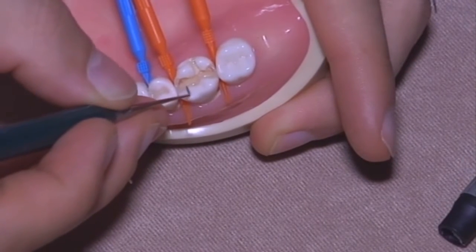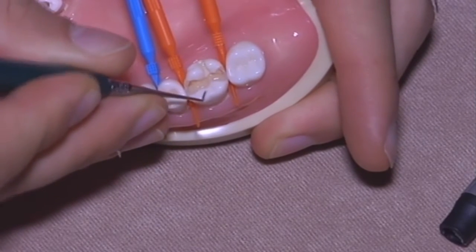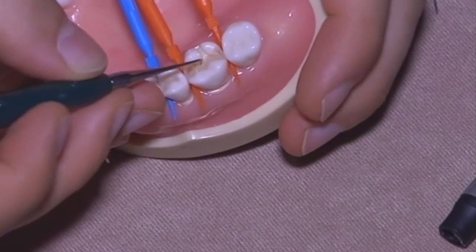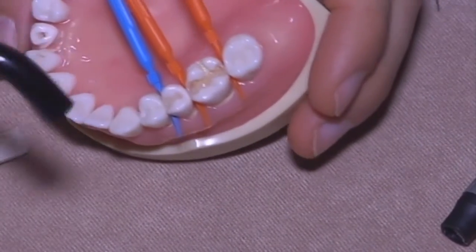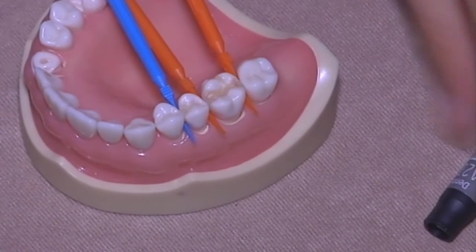The anatomy starts from the dentin. The other suggestion is to immediately remove the excess. And light cure. Fourth layer.